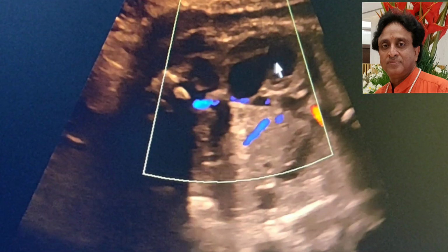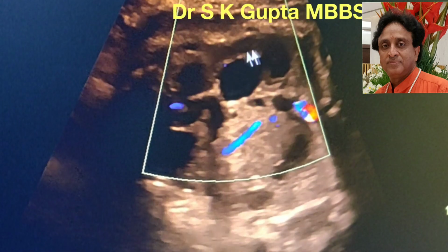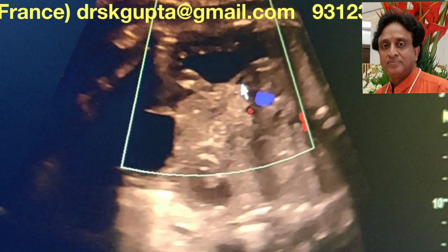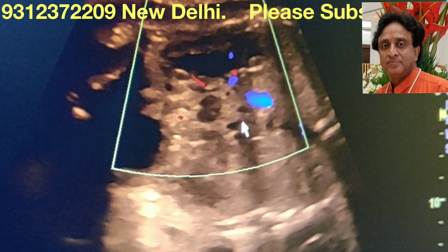This is the right kidney. This is the right kidney, and this is the whole renal pelvis being seen so clearly. And you can see that this is the renal vessel. This is the renal vessel supplying the kidney. I am trying to focus. This is the renal artery on the opposite side.